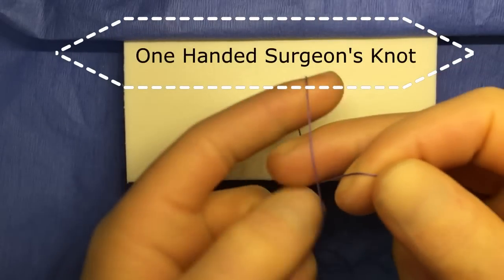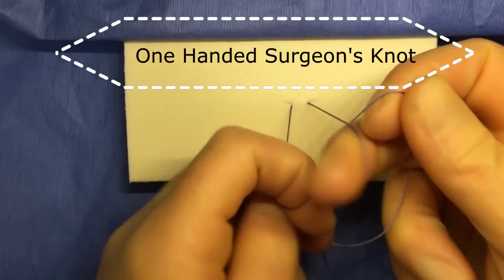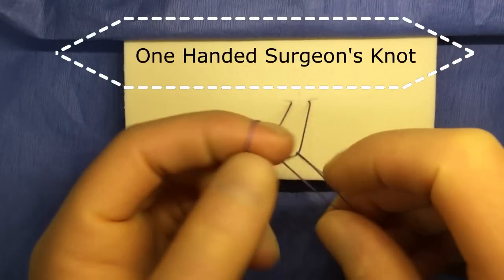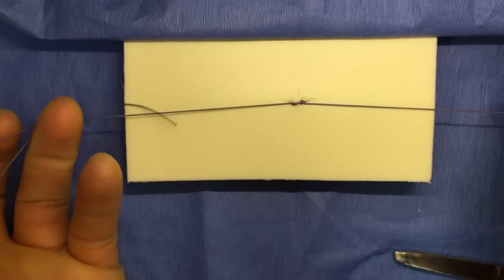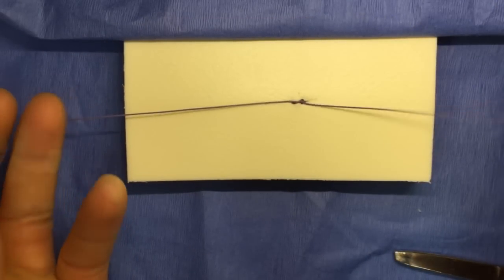My name is Graham Stroob and I'm an ENT resident at the University of Washington. Today I'm going to teach you how to throw a one-handed surgeon's knot, which was taught to me by Dr. Scott Bevins, one of our former head and neck fellows.